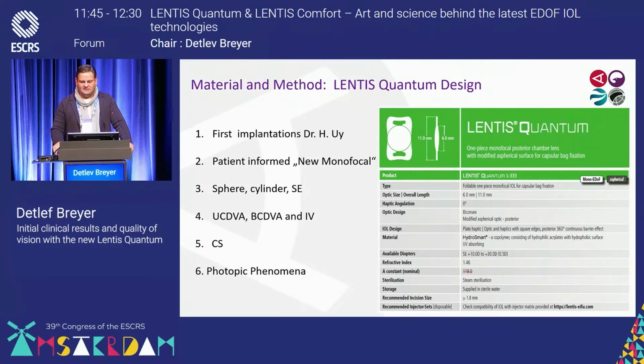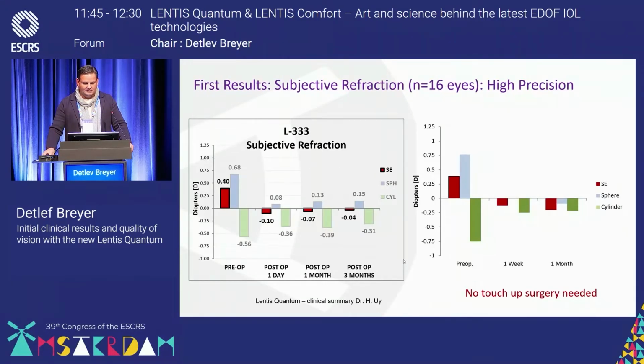All of you know this design from the other IOLs up to now, and I'm going to report about the first implantation from Dr. Uy, and we implanted the first CE mark. So those data are mixed together or compared more or less, and we are looking at all the numbers you would like to know about this IOL.